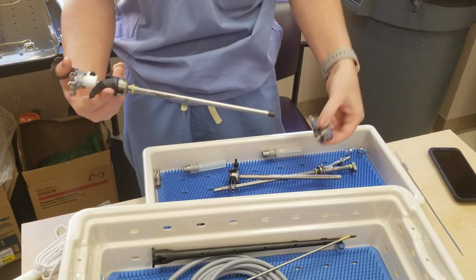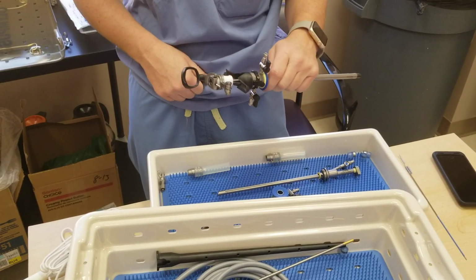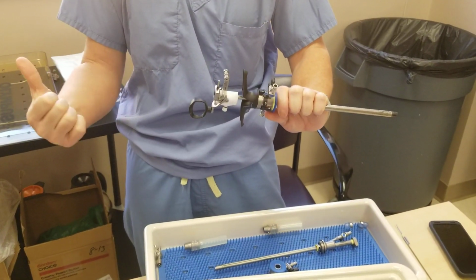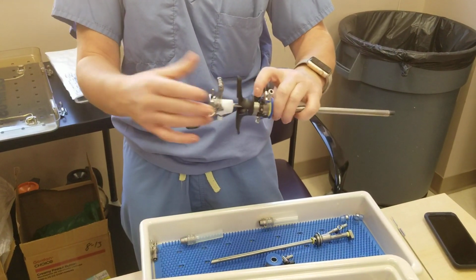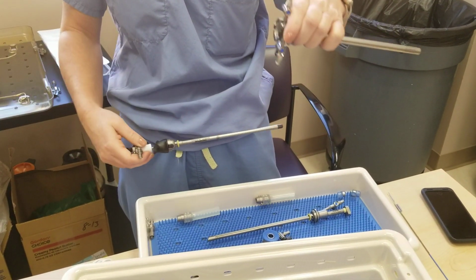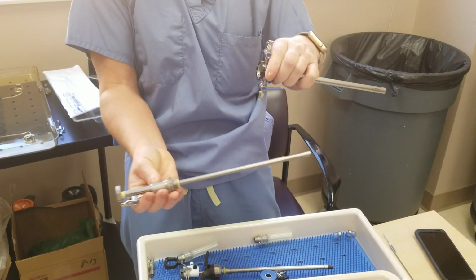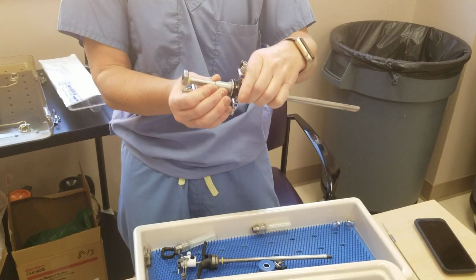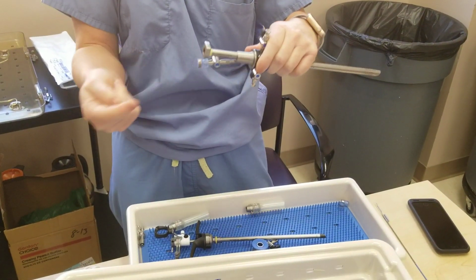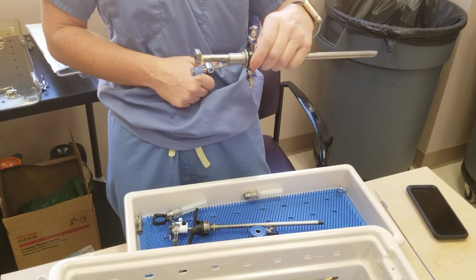If you are doing a TURP, and you realize, oh my goodness, they've got a bladder stone, or we want to use a grasper or anything like that, you don't have to open up a whole new cysto set to be able to have a channel to fit a grasper or a laser fiber through. You can remove everything but the inner sheath, which will still be in the patient, and use what Olympus calls a laser bridge. And it just snaps in, and then now you just put your little seal on, and you've got a port for a laser fiber or grasper, green light laser, whatever else you want to use. Okay? Perfect. And that's it.